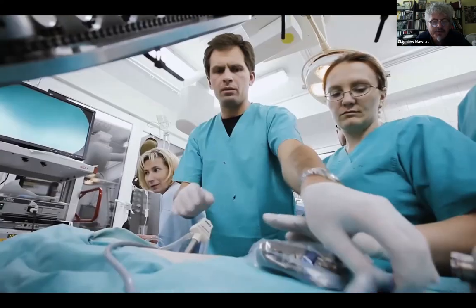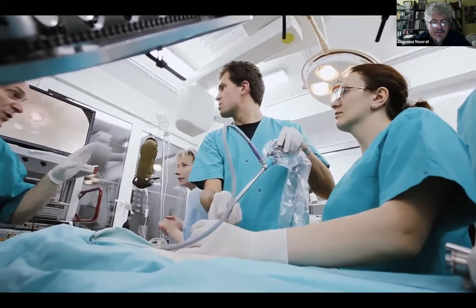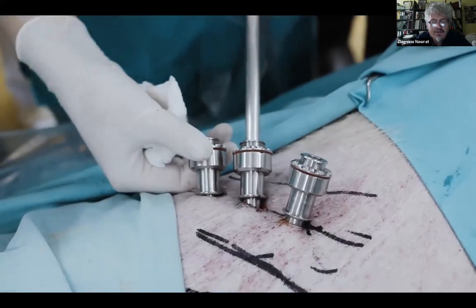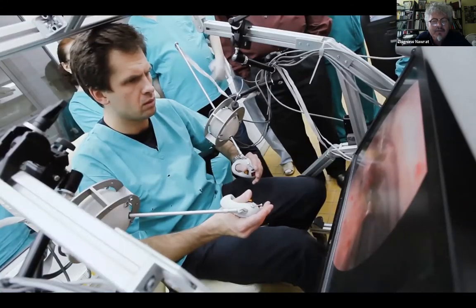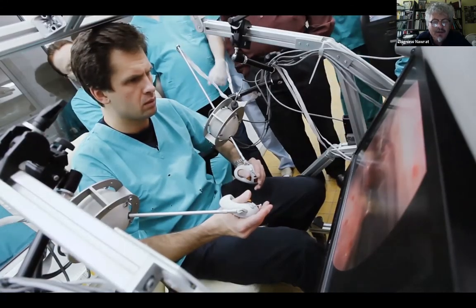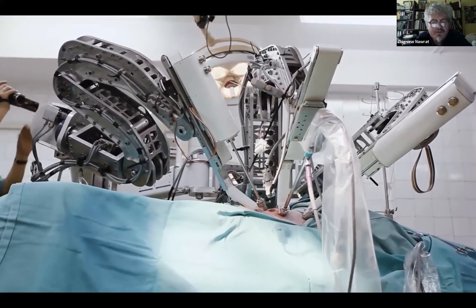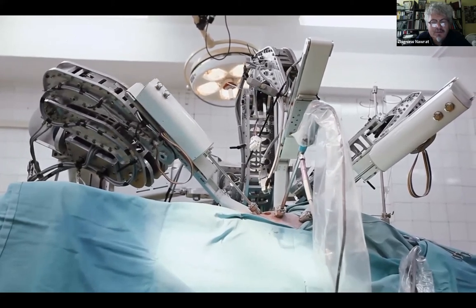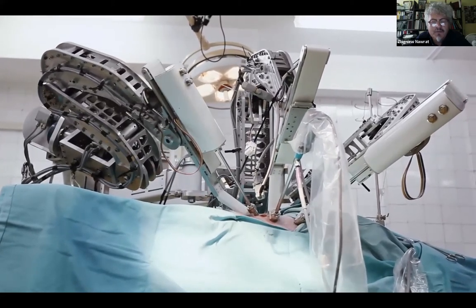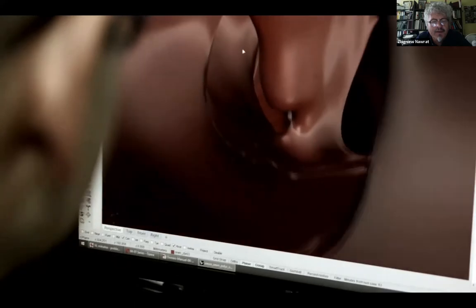And a few pictures from our animal tests. Michał Zembala and Janusz Śliwka, two cardiac surgeons, performed the operation on the pig. It is bypass surgery. Currently, the robot works on preparing the connection between the vessels inside the body.